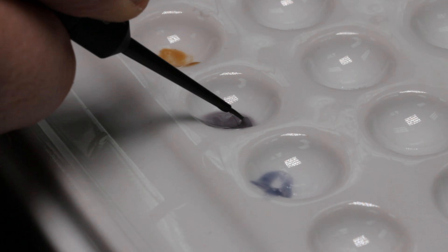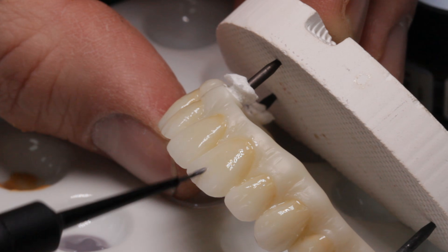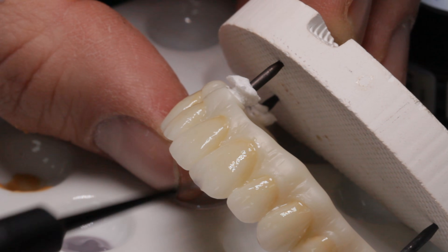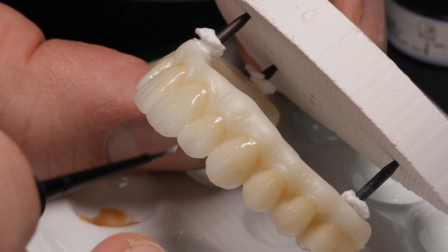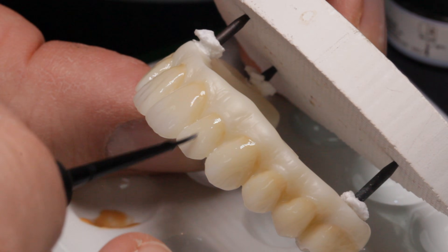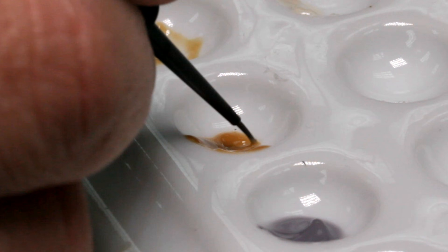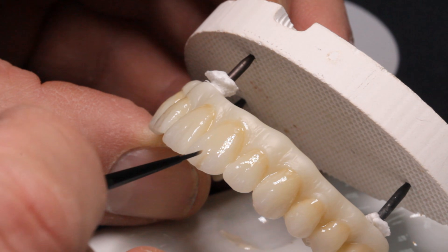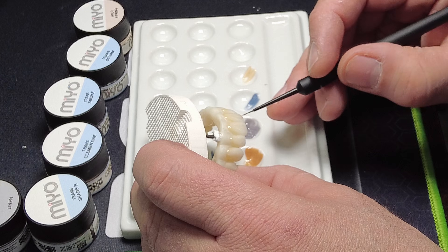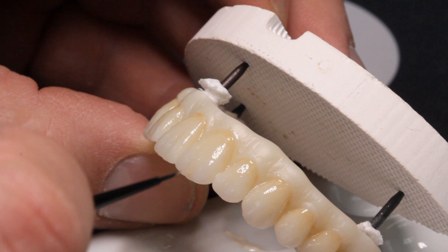Clementine is probably my most favorite stain in the Mio system. With Smoke, the purple-looking stain, I lower the value in the incisal edge and apply it in the upper third of the crown. Clementine is so versatile — I can also apply it in a thin layer at the incisal edge to give it an orange translucent look. Mamelon stains have some orange as well, but they are too opaque for this effect to shine through.